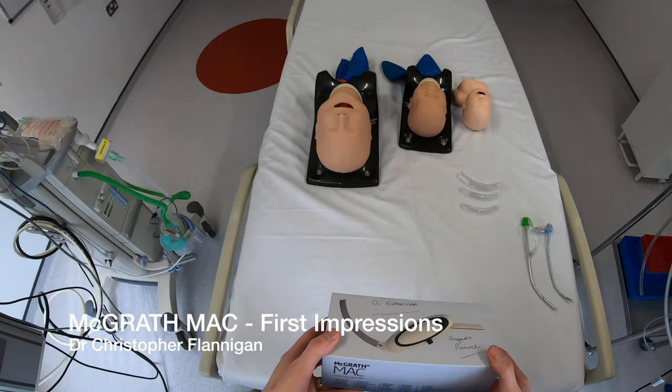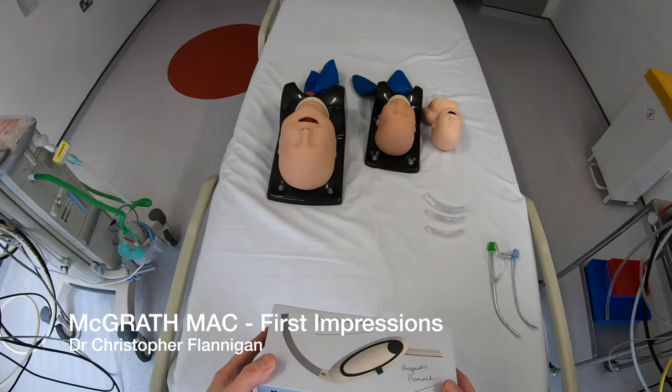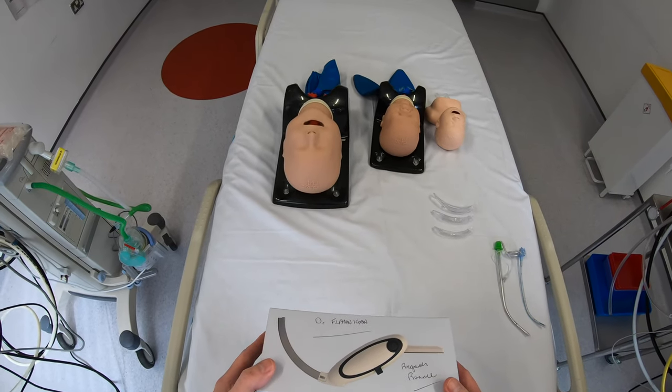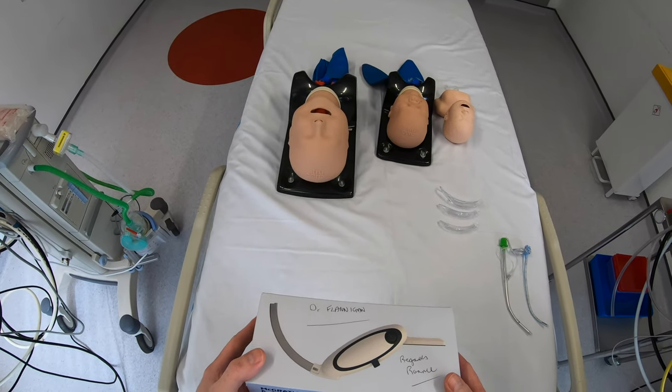Today I want to give my first impressions on the McGrath MAC video laryngoscope, and my thanks to Healthcare 21 for sending this through to review. The McGrath MAC has been around for quite a while and it's a pretty popular choice when it comes to a video laryngoscope for both adults and children.